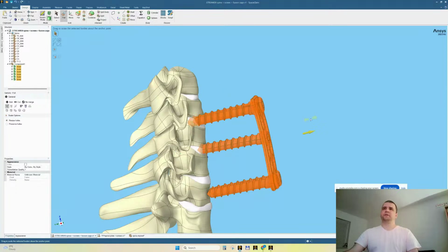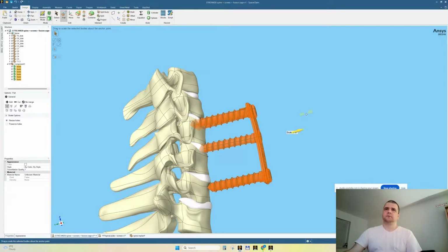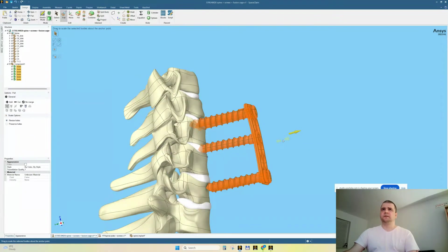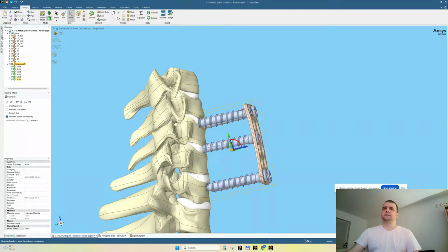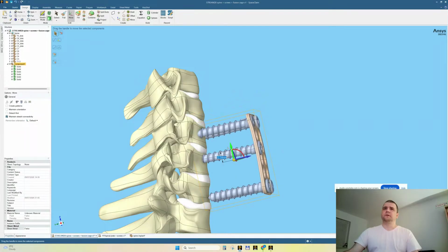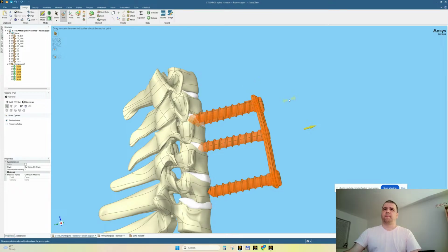I said something like 0.5, 0.7, but I can also drag with the mouse. What value is this? 0.67, or I didn't see it. We don't care too much, because in reality I would like for the screws to, yeah, so I need to scale it again. Control Z, Control Z. Let's assign another value. Maybe 0.85, a little less.